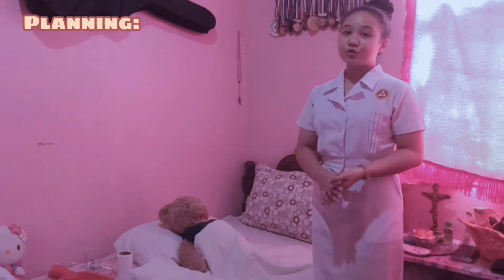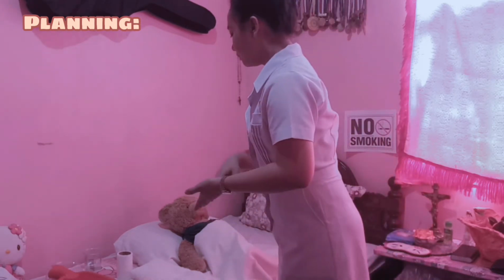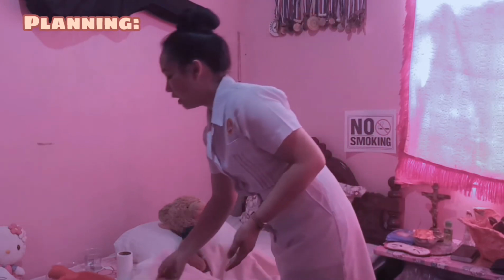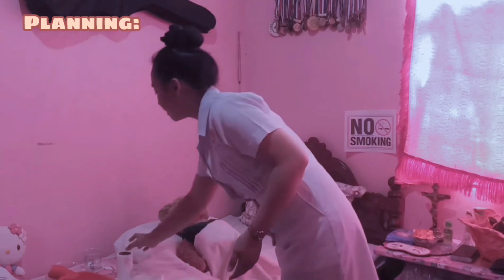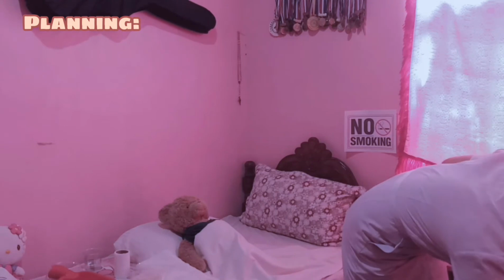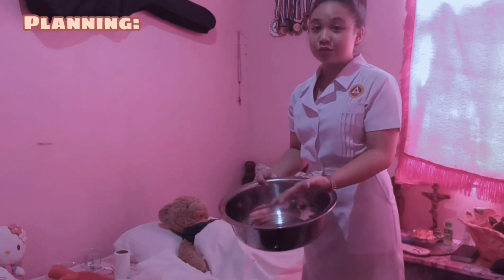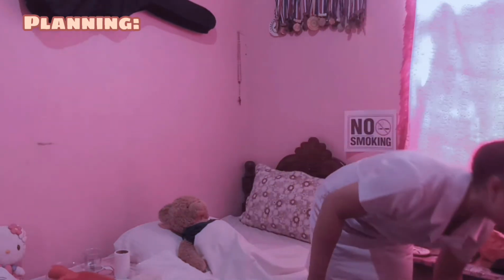And now we need to prepare and assemble all the equipment that we need. We have here the bath blanket or towel. We have also the clean gloves, the disposable linen, and the paper towel. And we have here the water-soluble lubricant, and also the commode or bedpan, but let's say for instance it is, but it is not.